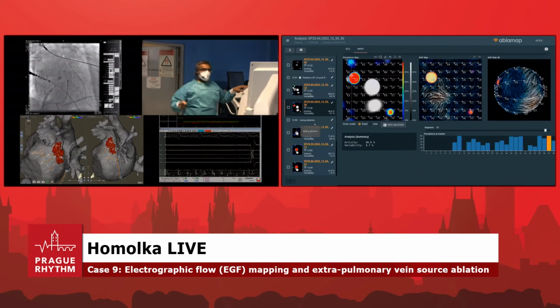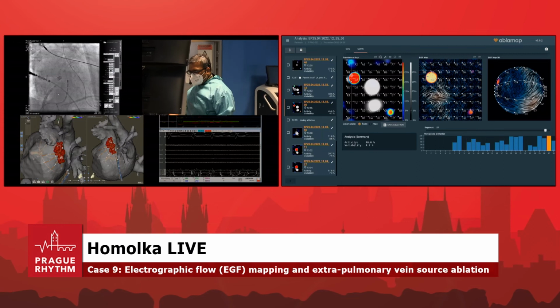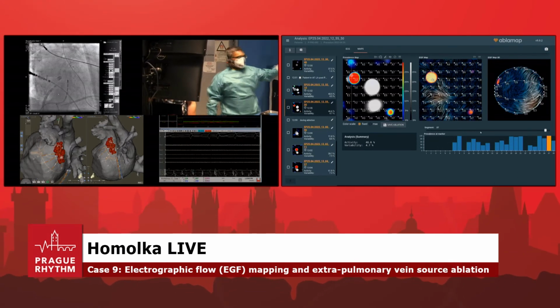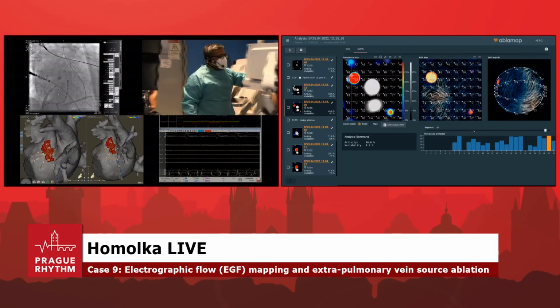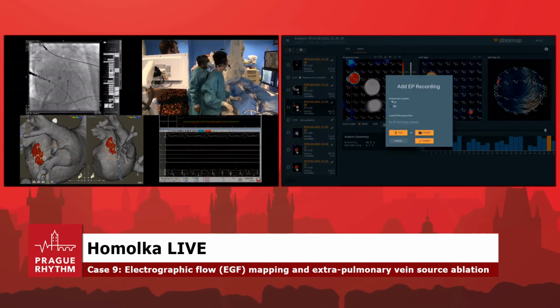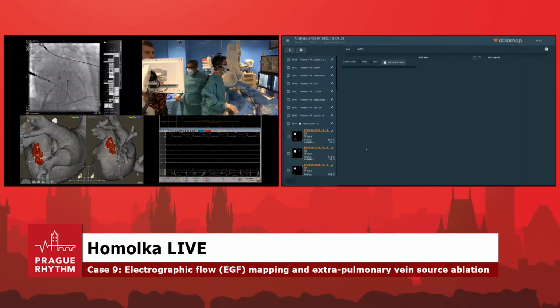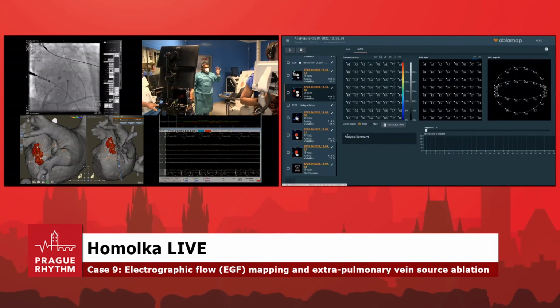So now if we show the EGF map, please. Okay, good. And you see there a big hot spot still, and that's 46% of the time. So the ablation, what it did, and if we look at that location, can you point that out, Stepan? If you rotate the map to the left a little bit, right there, that location is where the new hot spot was. And it may be either this sort of push that there, or maybe that was there the whole time. It's just not clear. So what we then decided to do was we put the Farapulse catheter in that location.